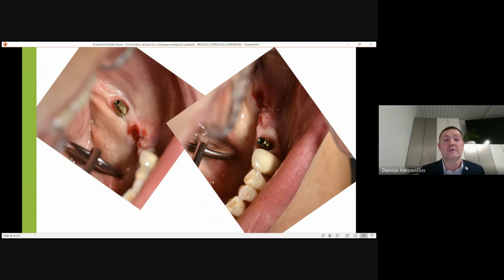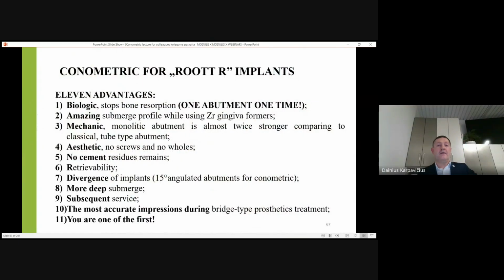So here are the tissues in the mouth on the day of periimplant treatment, and after treatment we give this bridge back to the patient, and we will see what will happen with this implant. Maybe for the future, I'm not sure. Maybe it will stay very stable and remain, or maybe we will have to remove it. But anyway, two implants are also not bad for this kind of bridge. It's a very fresh case, and I wanted to share it with you as well.